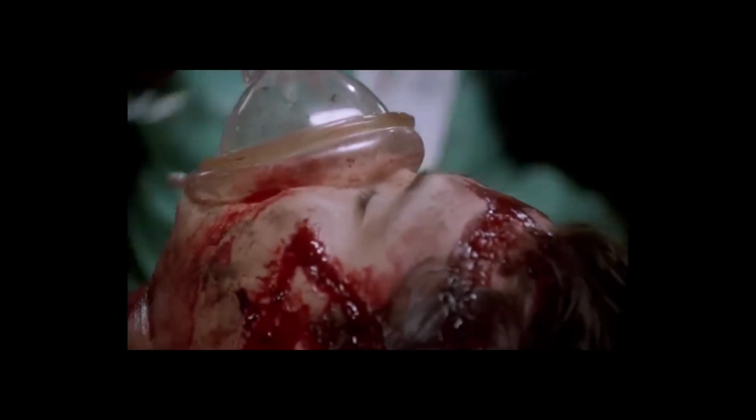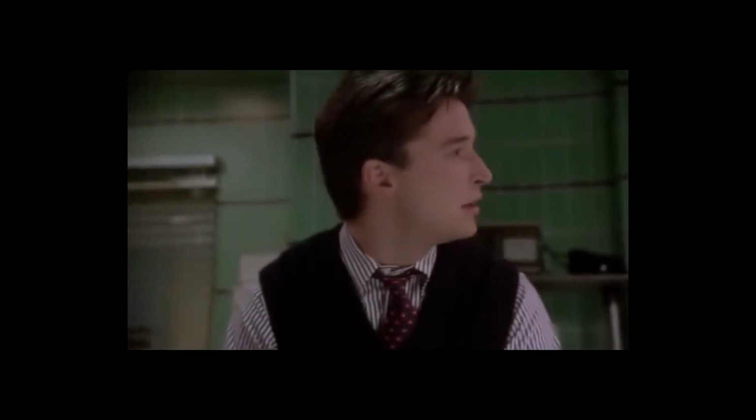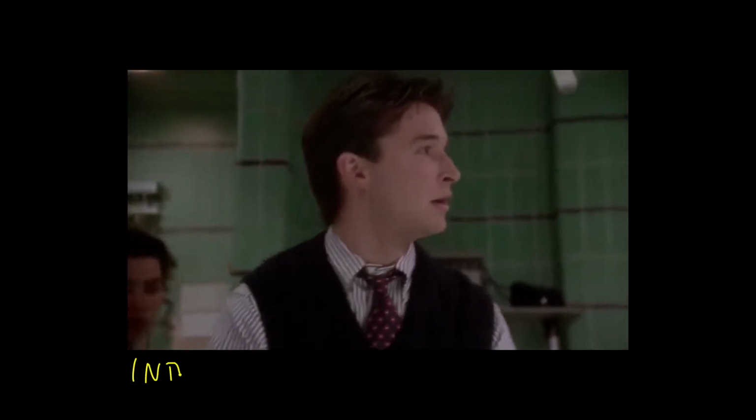Get it out of here. Let's intubate him. Carter, why don't you jump in here? Me? 7.5? You've seen about 50 of these by now, right? Okay.